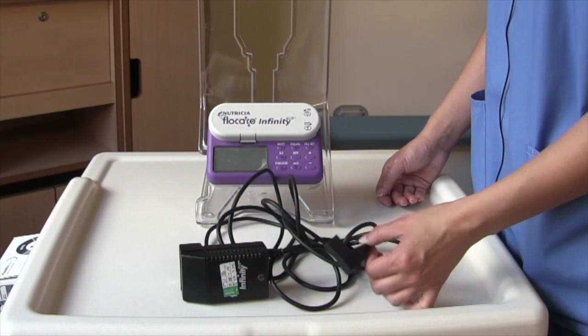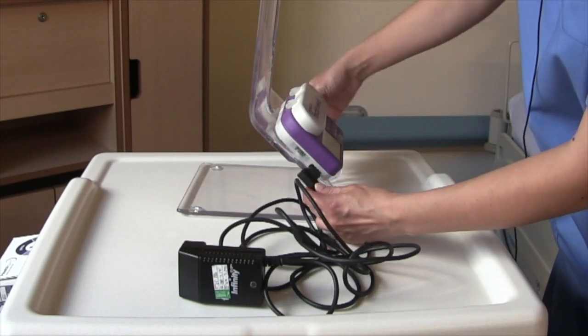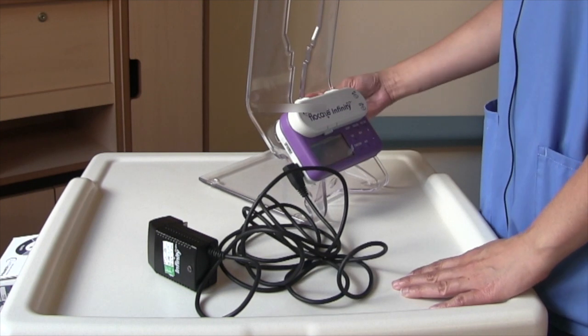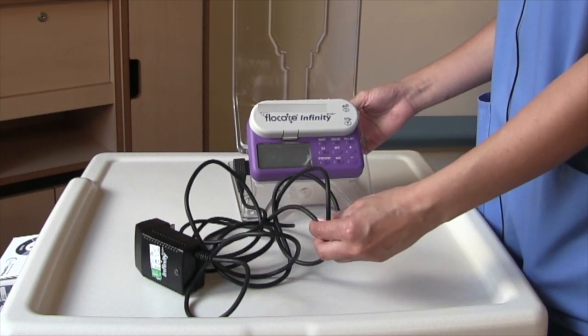After your feed is done, remember to charge the pump. There's a connection at the side here, and you can plug this into your main outlets. Once charged for 6 hours, it will give you a 24-hour battery life. You can also keep it charged as the feed is running.